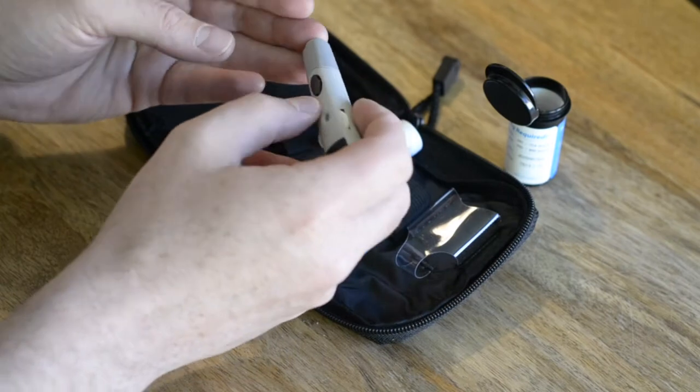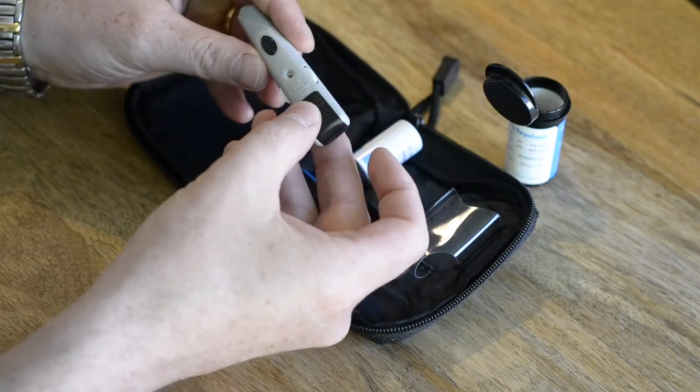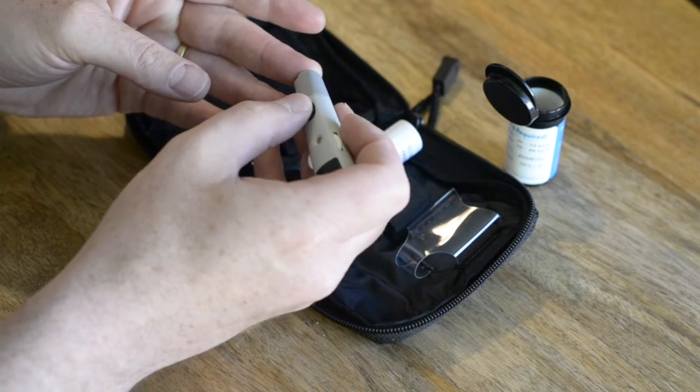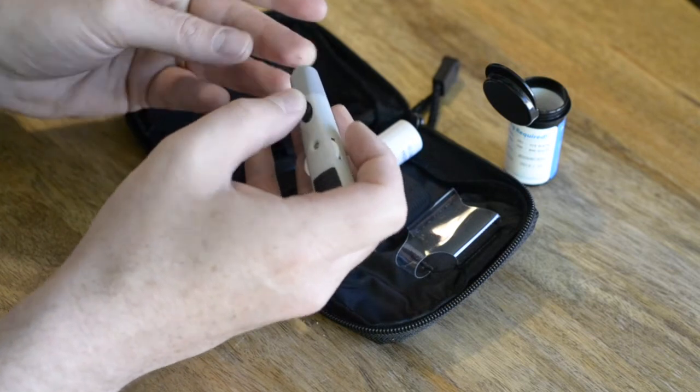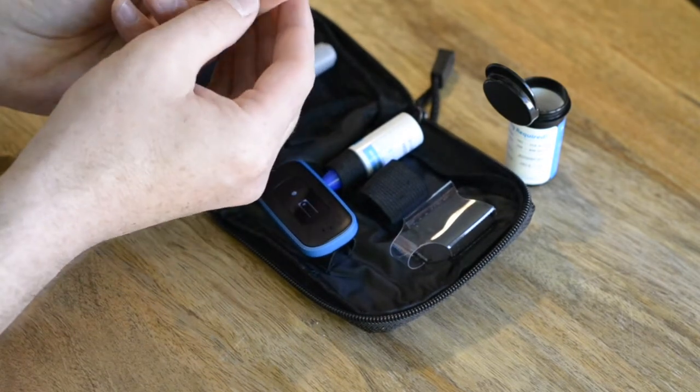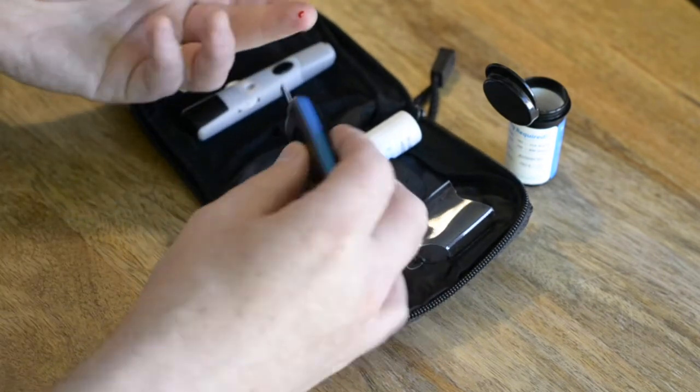As instructed by the app, now's the time to take a small blood sample. Use the lancet device, pull back the spring against the finger, then press the black button. You will feel a small prick. Now gently squeeze the area until a blood droplet forms.